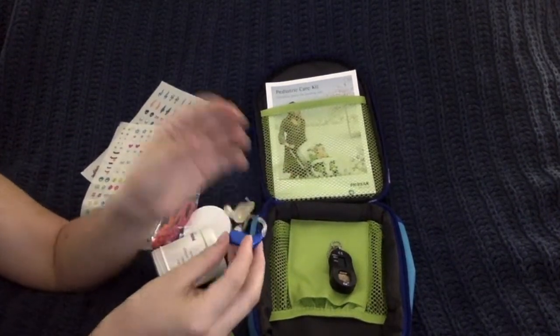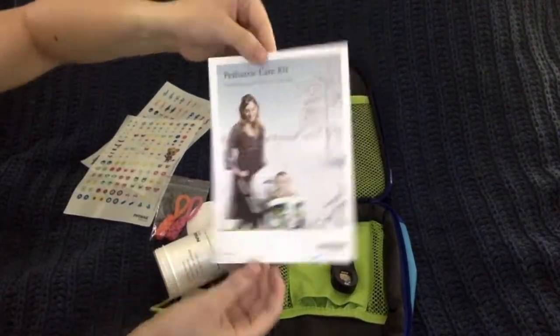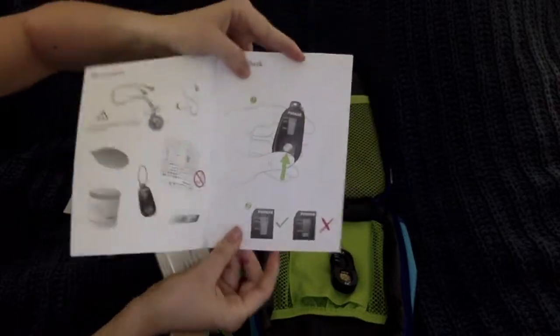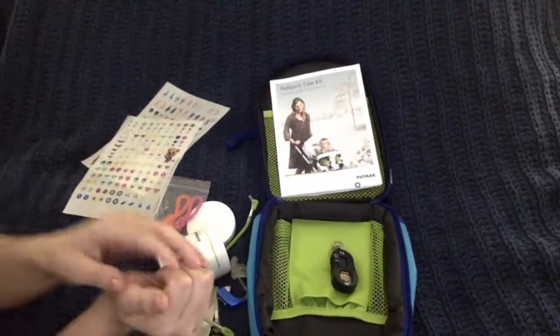Along with all of these items in the kit, Phonak also has the Pediatric Care Kit Guide, which goes over everything I talked about today in case you forget how to do a listening check or need a reminder of which tools do what.